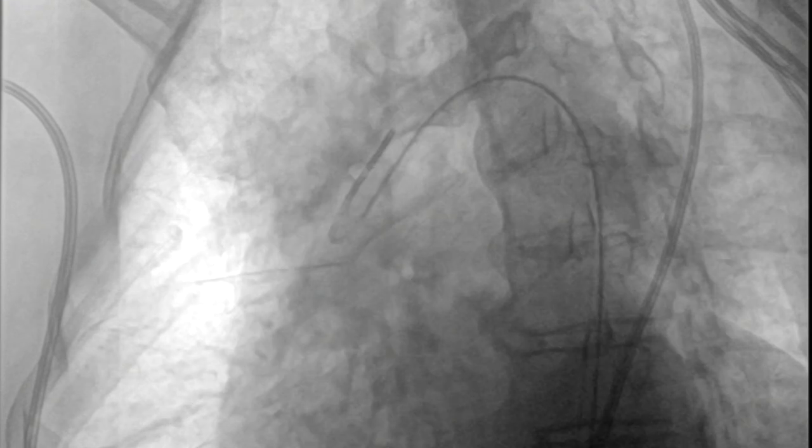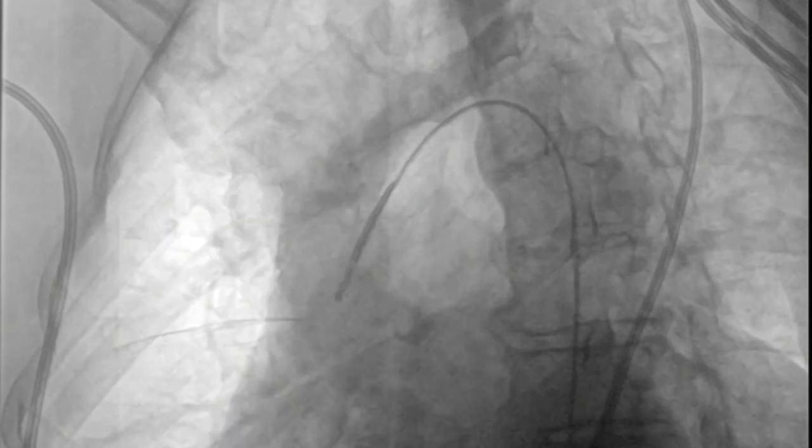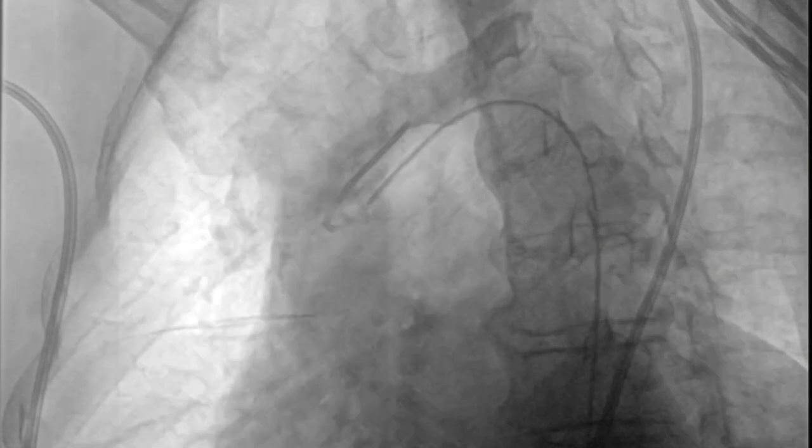The innominate has been catheterized. You then push the catheter forward to disengage it, rotate away from the origin of the innominate, and then rotate back to try and engage the origin of the left common carotid orifice. This can be challenging, especially if there is a bovine origin of the aorta.